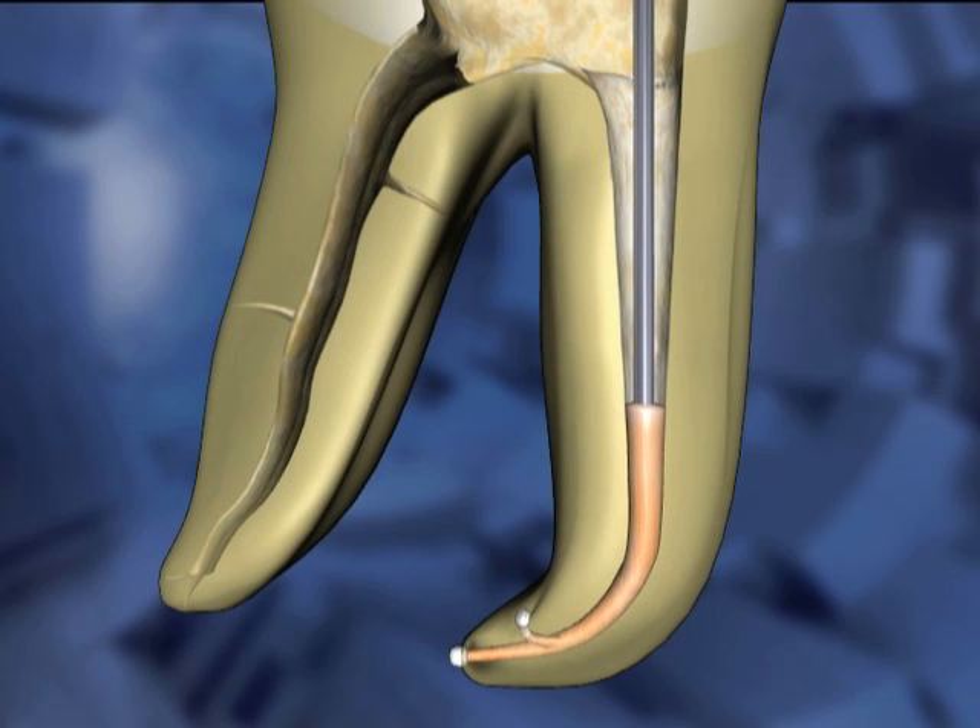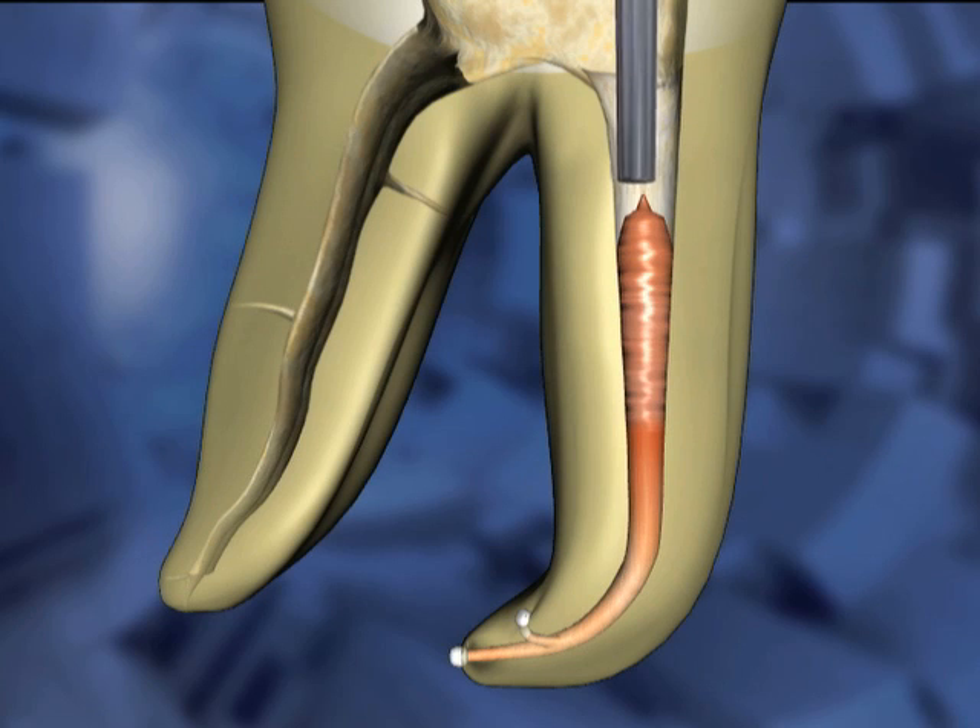Reinsert the Calamus needle into the canal space against the compacted material. Again, press and hold the activation cuff to restart the flow until a few more millimeters of the canal has been filled. Release the activation cuff to stop the flow. Remove the needle and use another plugger to condense the material. Repeat this process until the canal is filled to the desired level.